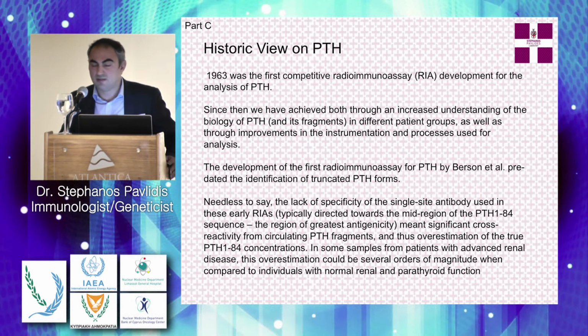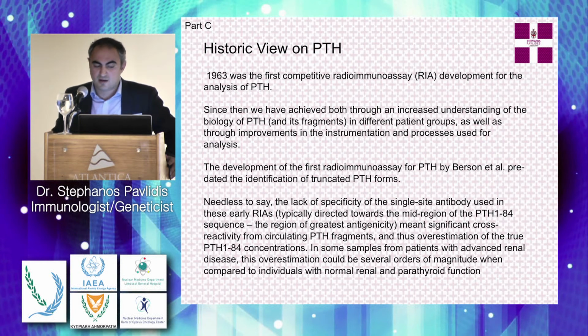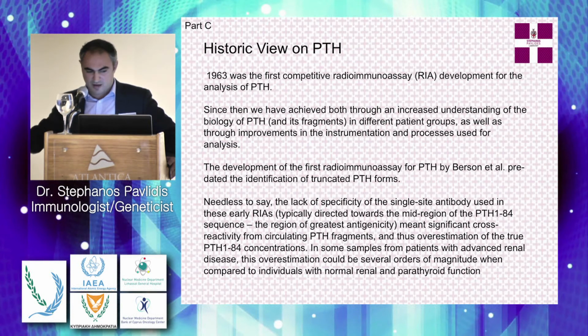It's important especially to give some historic view on the PTH testing. In 1963 was the first competitive radioimmunoassay developed for the analysis of PTH. Since then, we have achieved progress both through an increased understanding of the biology of PTH, as I mentioned earlier, and its fragments in different patient groups, as well as through improvements in the instrumentation and processes used for analysis.